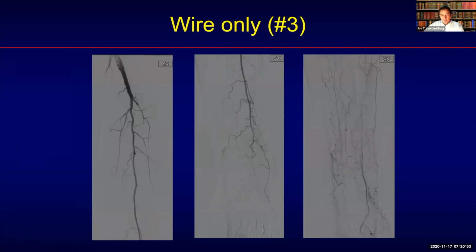Of course, it's very important to work very carefully not to lose this collateral, especially if it's one of the last. Therefore, I would recommend not to start with difficult cases like this, but use cases where the collaterals are not really very important, as in the first case that I showed you.